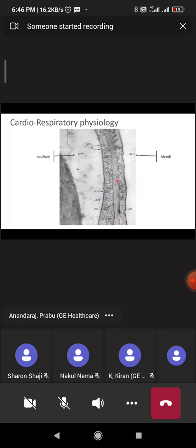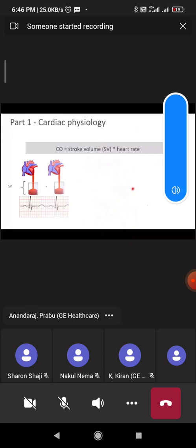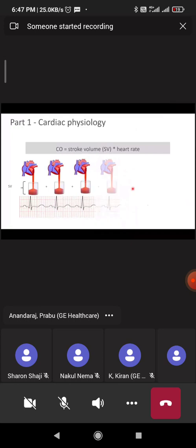But as long as it is not a structural problem, you can adjust your settings. You can play with your E time, you can play with your respiratory rate. You need to reduce your tidal volume. If there is a lot of dead space, that's because there's too much volume. So these are some of the ways we can try to address the dead space. And of course, use chest physiotherapy. If there are any secretions creating this problem, put in a suction and clear them so that the gas can really go and start participating in gas exchange. All those things are the ways that we can control the dead space.